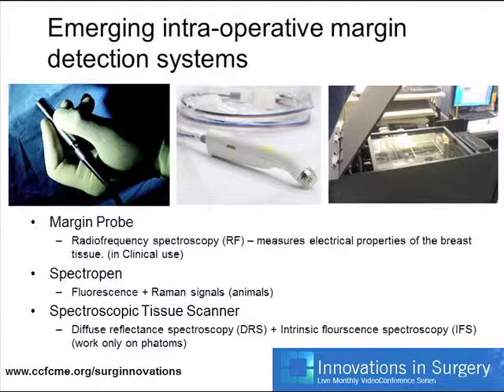And all of these techniques rely on some form of spectroscopic analysis of the tissue, but quite often they don't necessarily provide information if you're interested in biomarker discovery, because you've got to have some sort of a priori knowledge of the tissue that you're studying before you begin to analyze it. There has been some data on their use. I haven't specifically included, by the way, data on optical biopsy or on endoscopic therapies, because they obviously don't rely so much on spectroscopy.